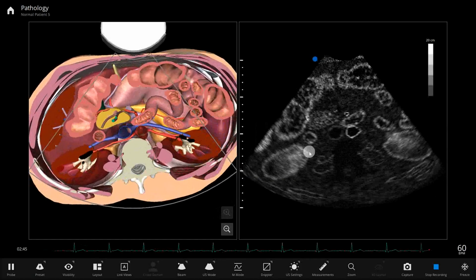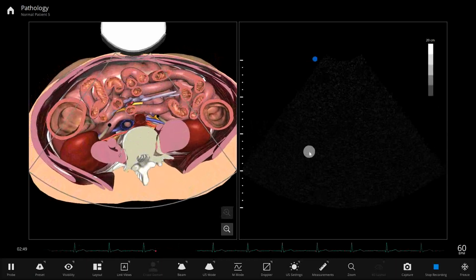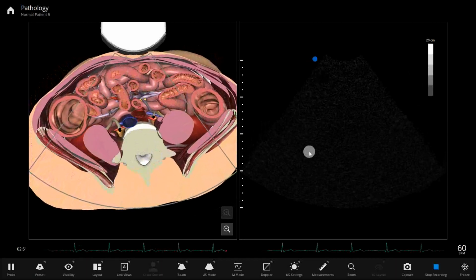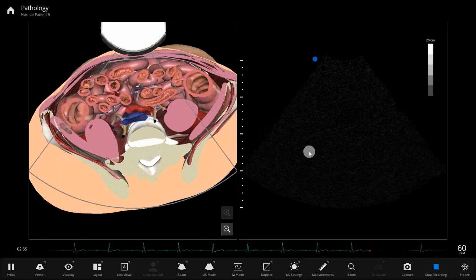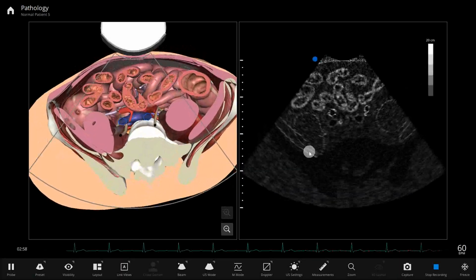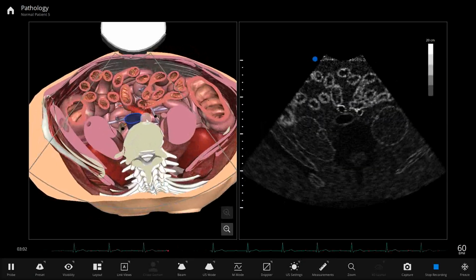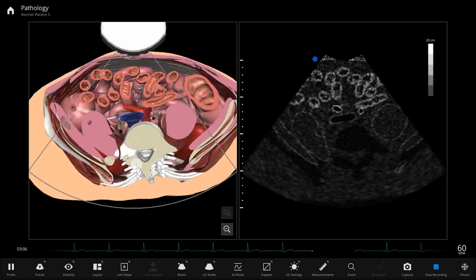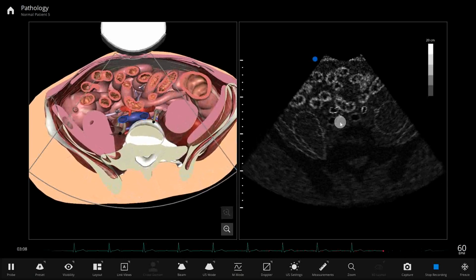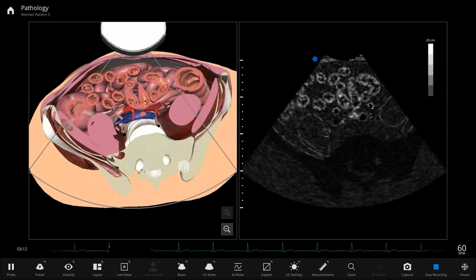Okay? Now as we come down a little further, we can watch for where the two iliac veins converge to create the IVC. Okay, from inferior it's going to look like it's split. So here is that IVC. You'll see it elongates, gets wide, and then it becomes two vessels. Each of those is an iliac vein. We have the left and right iliac vein.